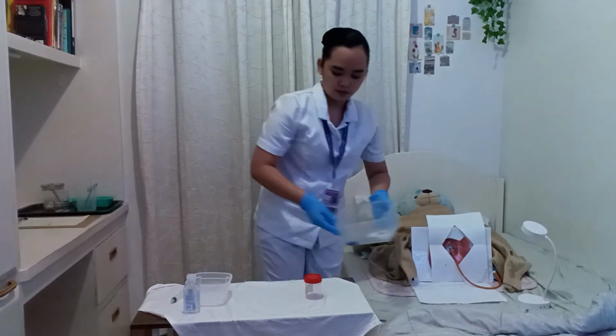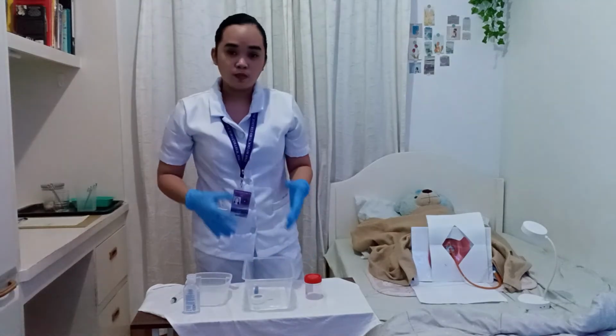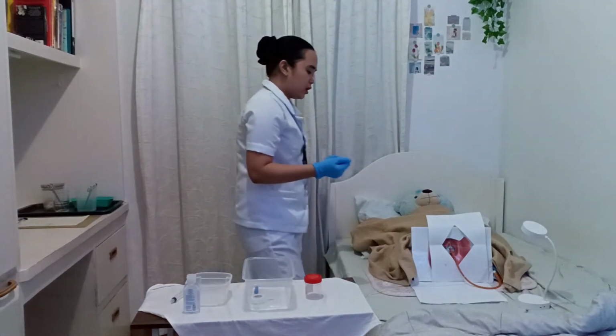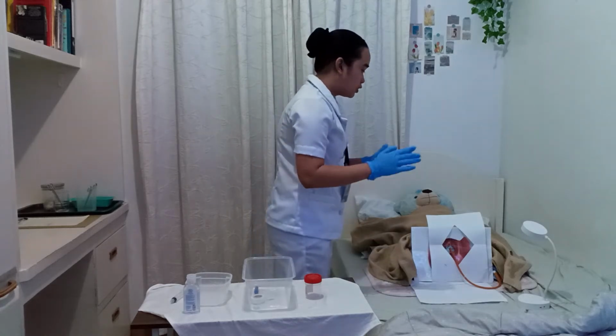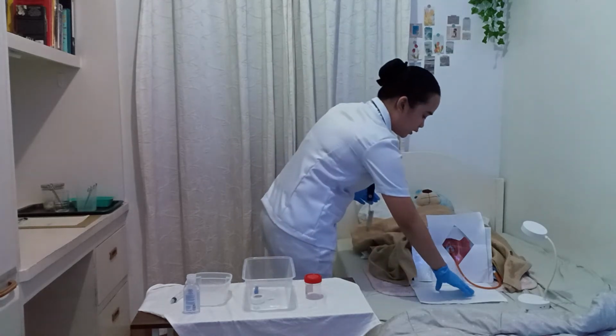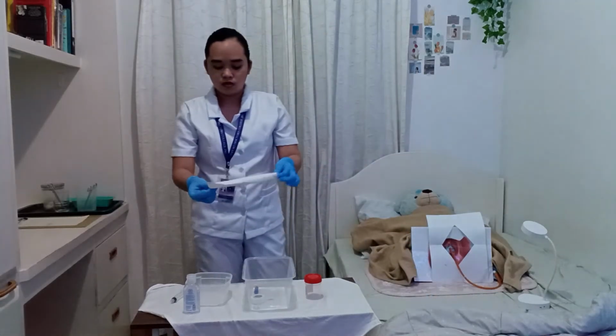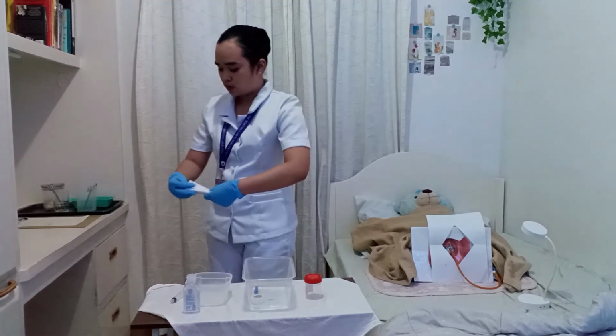Alright. So now position the patient comfortably to promote relaxation. Okay, so now ma'am, I'm now going to remove the absorbent pad and the eye sheet. I'm going to discard this one.